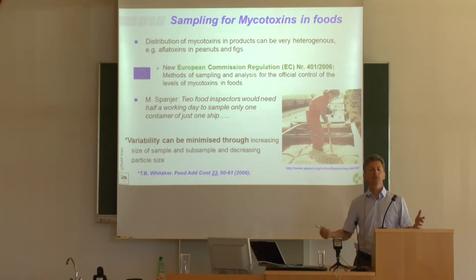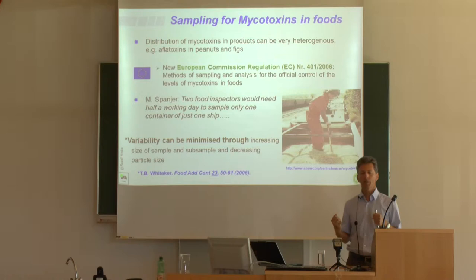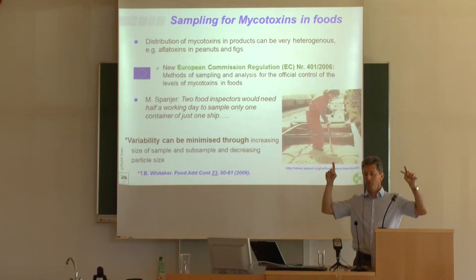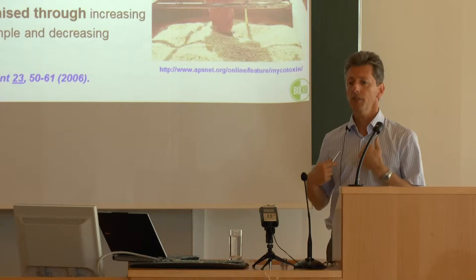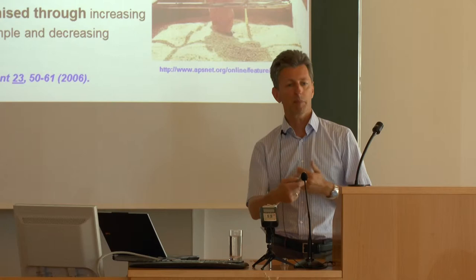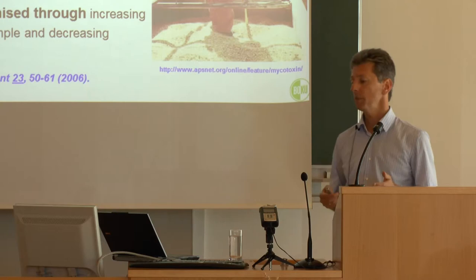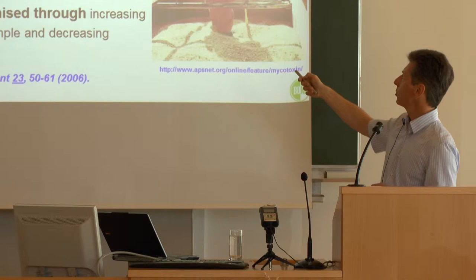Sampling for mycotoxins in food is always considered the most critical step. If there is a hot spot — say a peanut containing 500 micrograms per kilogram aflatoxin B1 — and you have other peanuts that are not contaminated at all, picking a non-representative one can give completely different results with differences of several hundred percent. Running a lab, we can only provide advice; we are not responsible for the sampling, but for control purposes such as importing grain, proper sampling is certainly of great importance.